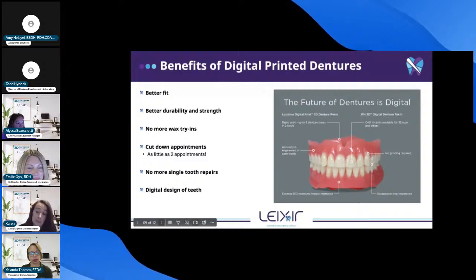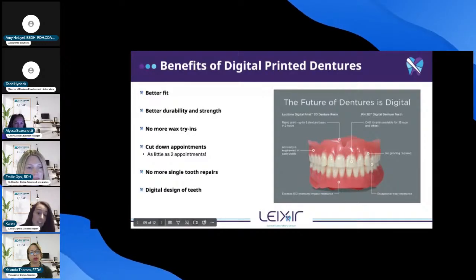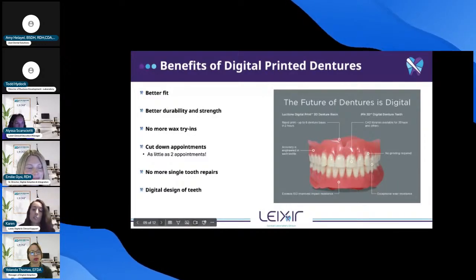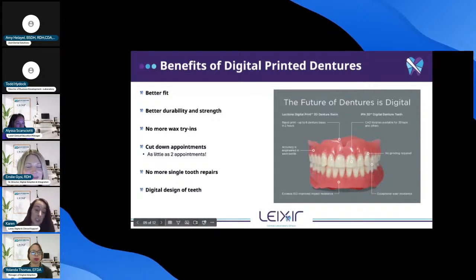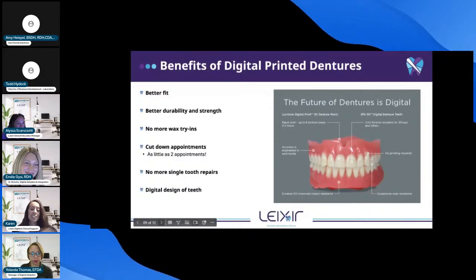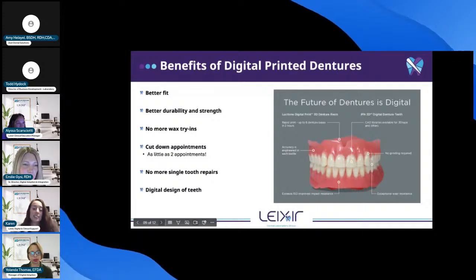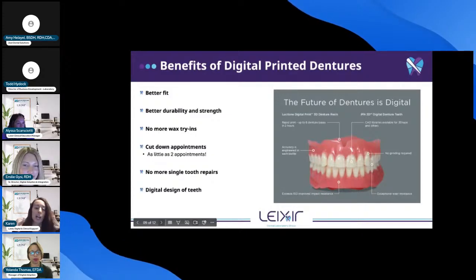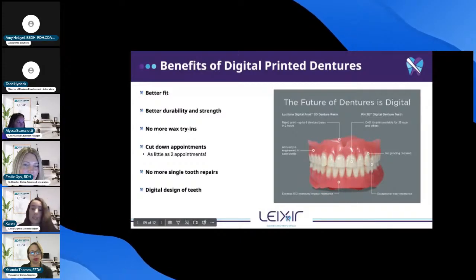I really like them for full arch, whether it's for locator overdenture or for locator fixed. I think they look really nice. In my opinion, they look a little bit more realistic because they're custom to that patient. Which brings me to the points that I made earlier with photos. We need photos. Facial, smile, over-exaggerated. We need all that to make sure that these teeth look as realistic as possible, so that patients are extremely happy and tell everybody about you, so they keep coming back.